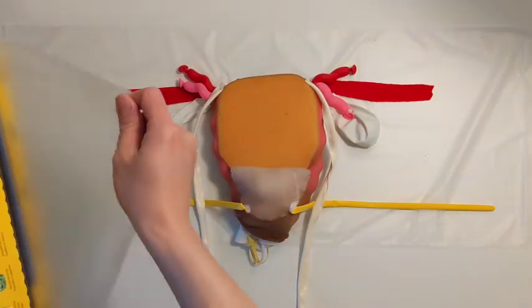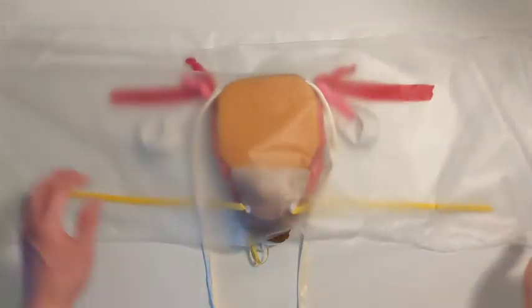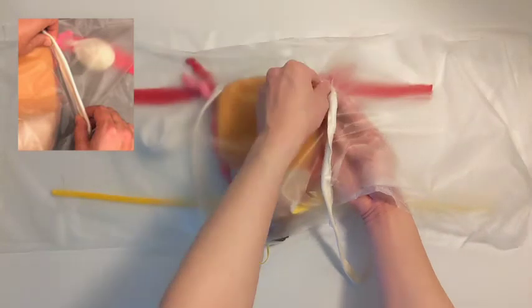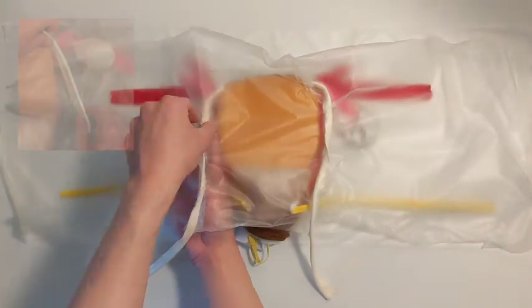Cut a second sheet of press-and-seal slightly larger than the first sheet. The additional length will help cover the round ligaments. Note that the sticky side of the press-and-seal should face away from you this time. After you place this sheet over the model, first wrap the round ligaments with the top layer of press-and-seal, just lateral to the uterus.